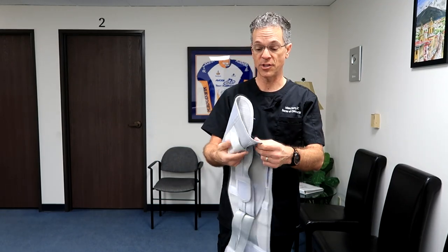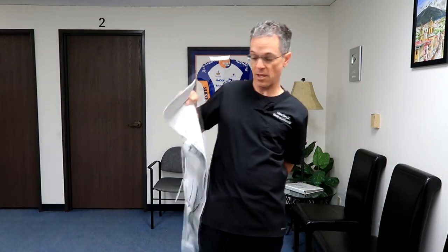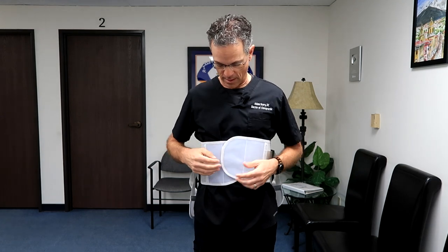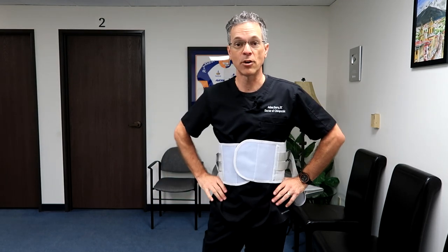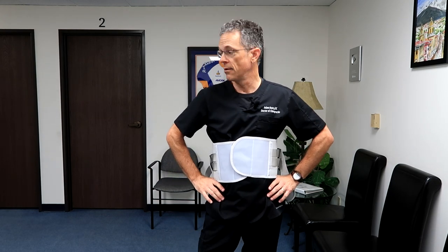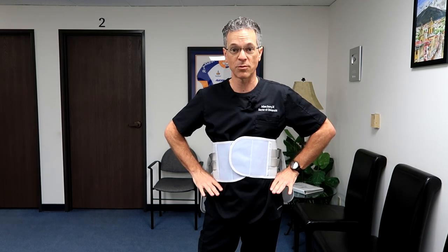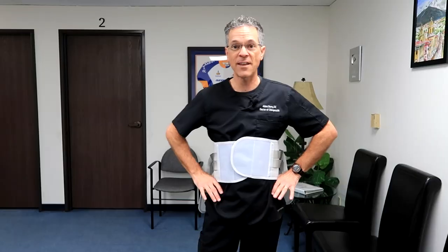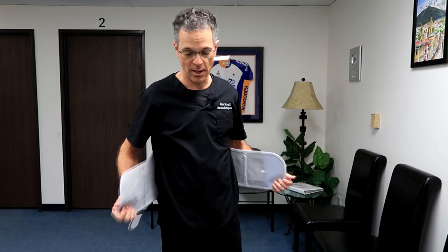Let me show you exactly how to use this, because most people put these on wrong. First, let me show you how to do it wrong — most people will put it too high up on their body. The way to know where to place it is to put your hands on your hips like you're mad at someone. If the back brace is above your hips, then it's too high. Wherever your hands are, you're going to place the brace about two to three inches below that.